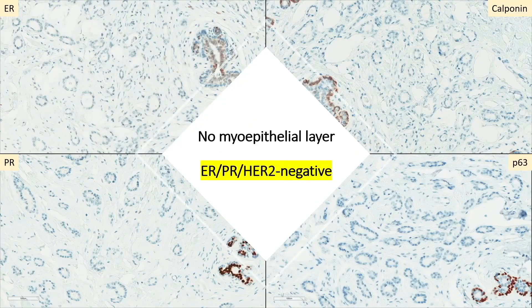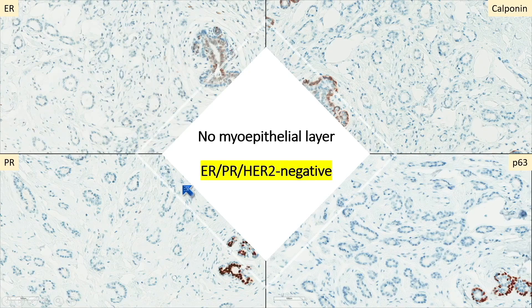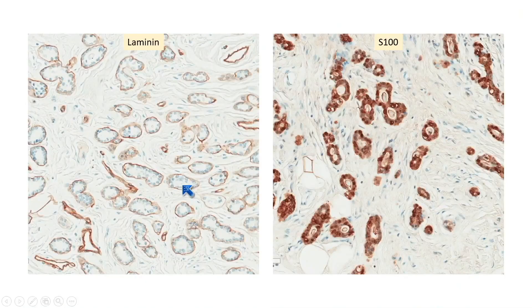This case came with a diagnosis of invasive carcinoma. The glandular proliferation does not have a peripheral myoepithelial layer surrounding the glands, and it is triple negative. Here are ER and PR with proper internal controls. If a diagnosis of invasive carcinoma is considered with this well-differentiated morphology and triple negative status, this is discordant. So we did more stains.